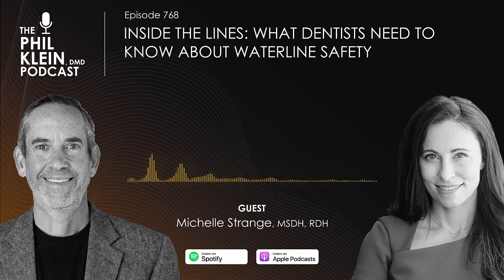What if the water flowing through your dental unit isn't as clean as you think, and how would you even know? We trust that if incoming water meets municipal standards, we're safe. But inside those narrow dental unit water lines, biofilm can build and bacteria can rise unnoticed. So what does that actually mean for your patients? Are we talking about minor contamination or something more serious?